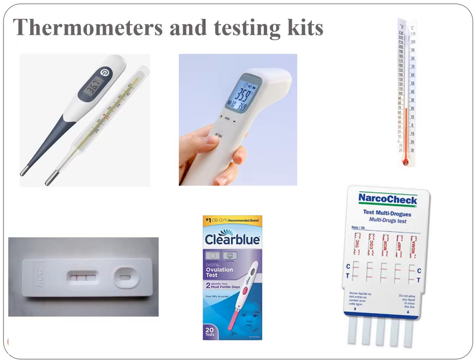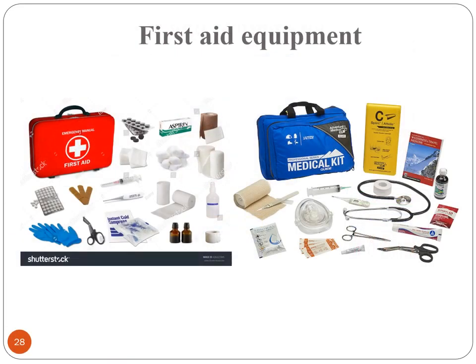And we have this test kit for narcotic analgesics or for drugs that are mainly abused, such as tetrahydrocannabinol, cocaine, morphine, amphetamine, and MDMA, which is an amphetamine. And also we have the first aid equipment, scissors, bandages, and so on.